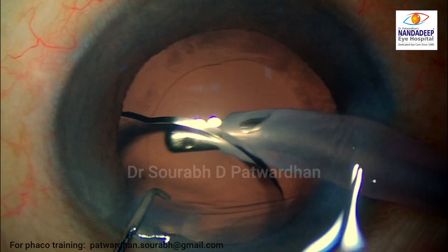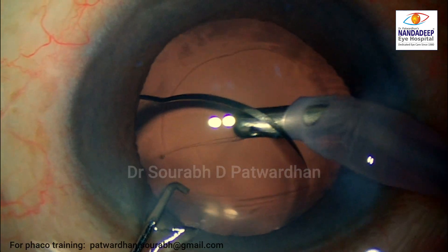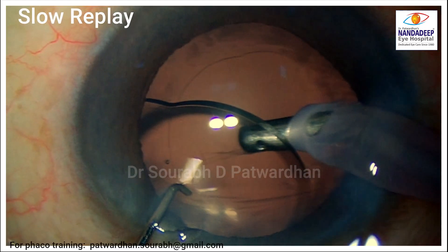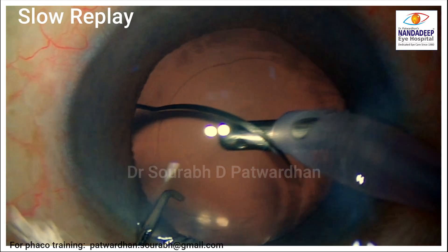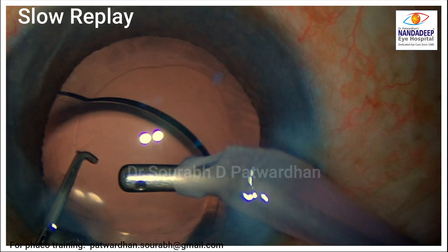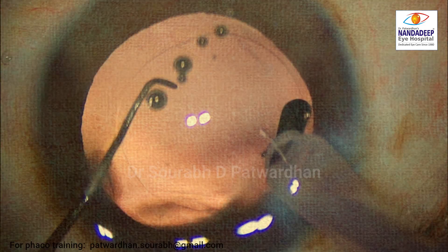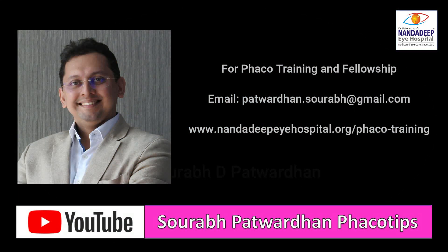Look at it in another case. This is also another common place to catch the posterior capsule — when you are removing the viscoelastic, the probe is sometimes turned sideways and the posterior capsule may be redundant at the end of the surgery. Always remember, whenever the probe tip is towards the posterior capsule or sideways, you have to be very careful. Watch the posterior capsule, and if it is caught, always hit the reflux button right away without moving the probe too much.